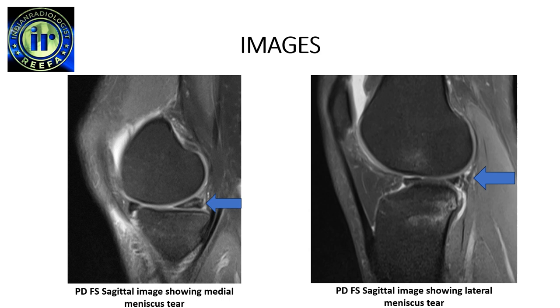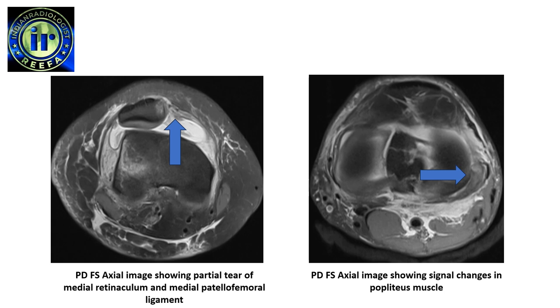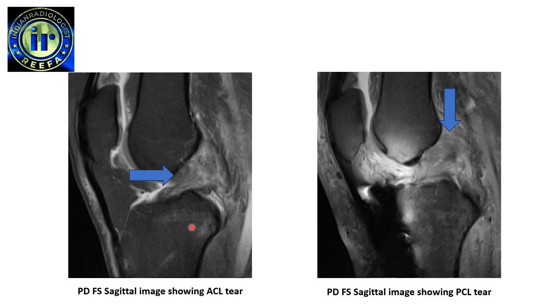In the image gallery, the first image on the left is a proton-density fat-sat sagittal image showing tear of the posterior horn of the medial meniscus. The image on the right is a proton-density fat-sat sagittal image showing tear in the posterior horn of the lateral meniscus. The next image on the left is a proton-density fat-sat sagittal image showing lateral collateral ligament tear, and another image showing partial tear of the medial retinaculum and medial patellofemoral ligament. The image on the right shows signal changes in the popliteus muscle, and another image shows complete tear of the ACL.